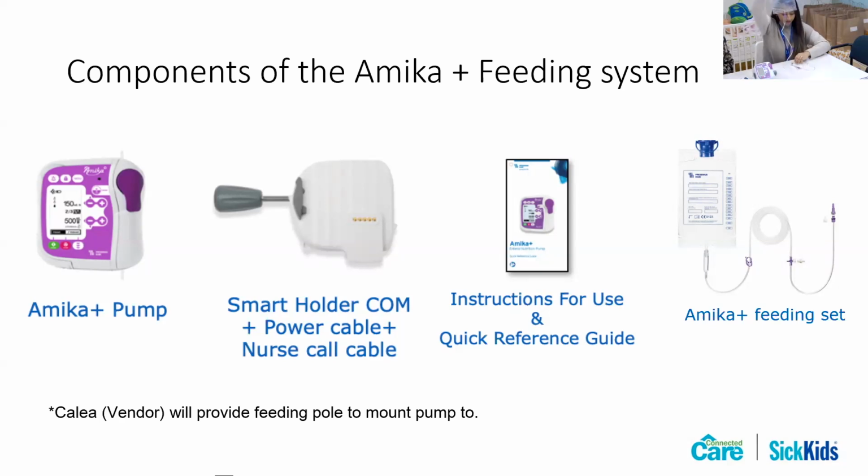Then we have here the tubing line. Essentially, this is already pre-connected, but it is a tubing from the feeding bag that then gets connected to the patient's feeding tube. Starting from the top, right just below the feeding bag is a drip chamber. So this right here is our drip chamber. Moving along with the tubing, we then have the clamp right here, which we can just open and close.